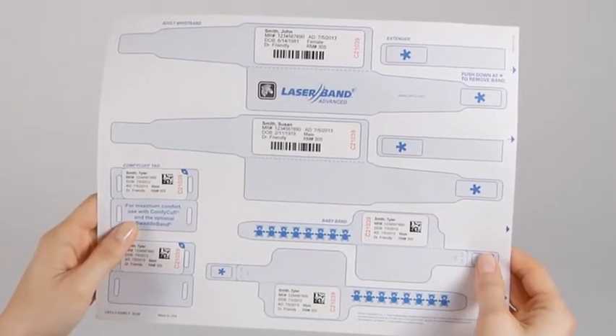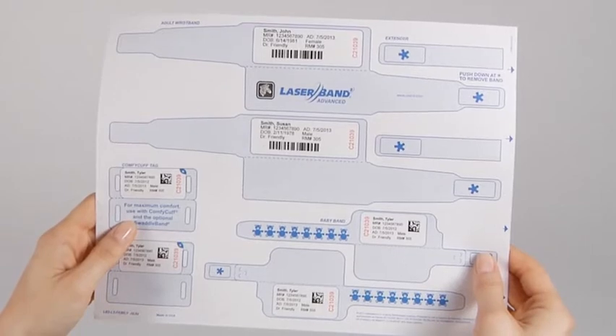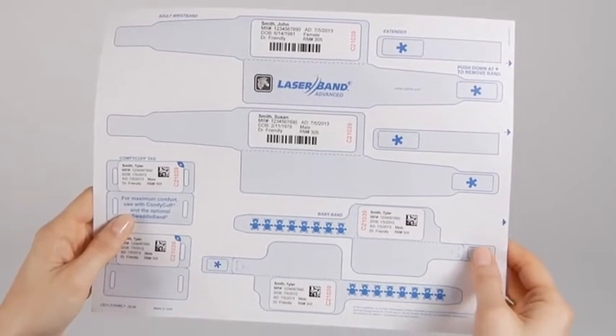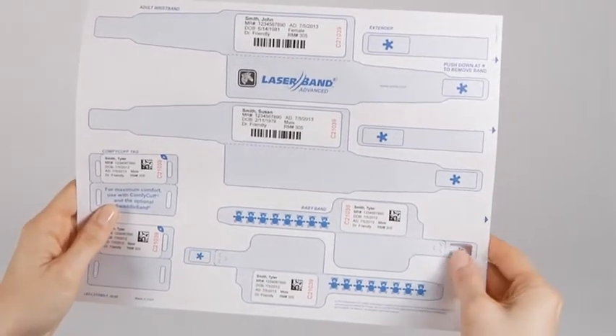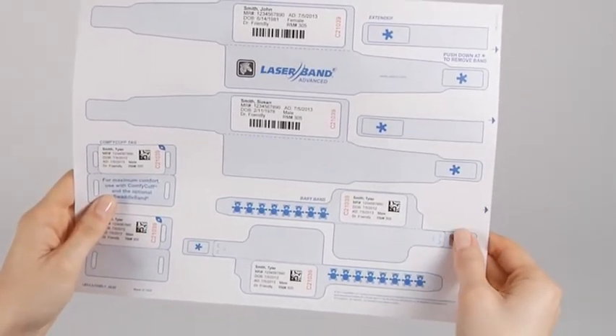Hold the printed sheet firmly, then press the blue asterisk on the wristband and push it through the sheet. Be sure to only press on this spot and not the shaded area, which is where the wristband is attached to the carrier sheet.